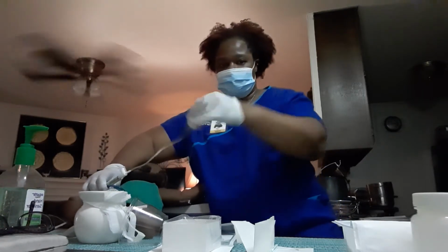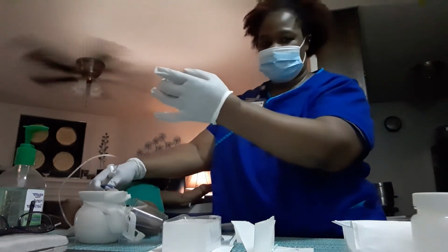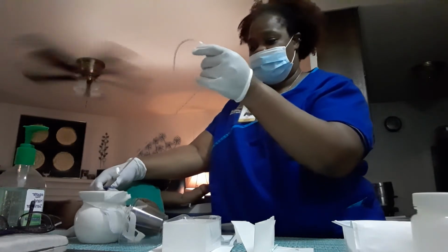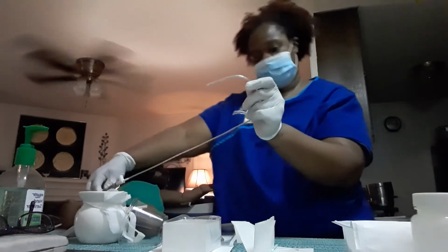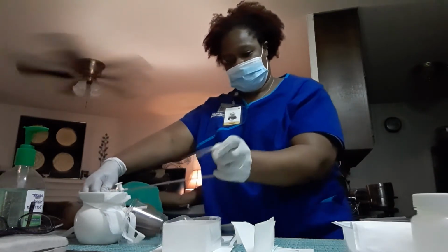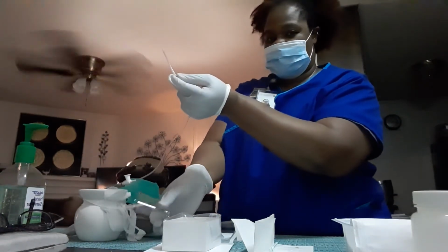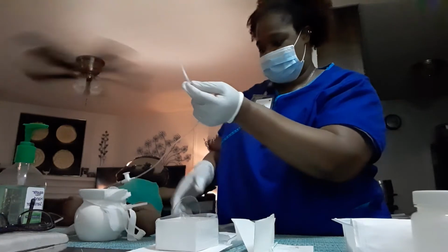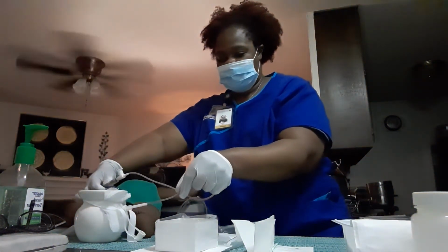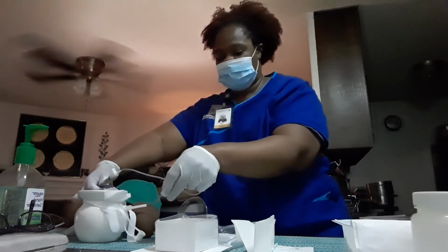Okay. If that happened, I would start back over. But I would take my tubing and moisten the tip. I would remove my mask, and I would insert the suction tubing till I'm at resistance or the patient started coughing.